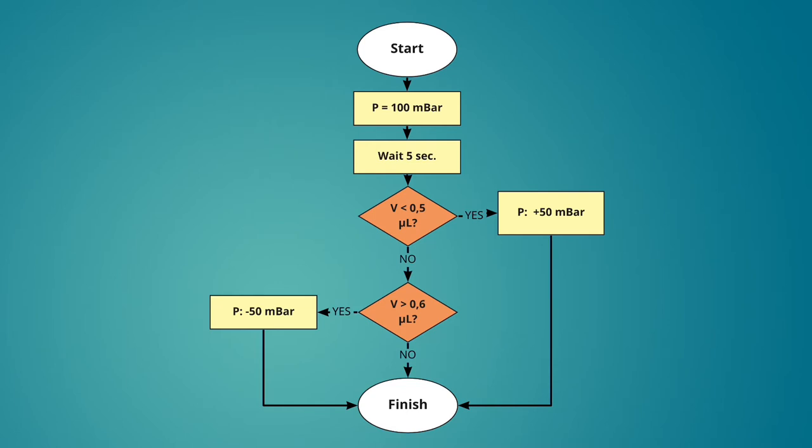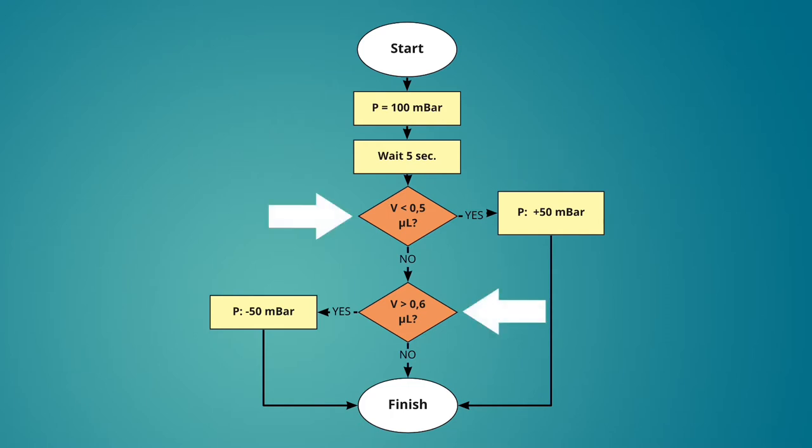In the beginning we will set the pressure of the controller to 100 millibar. After this the flow unit will measure the volume of liquid that flows through the channels. Based on this measurement after five seconds we will evaluate two conditions.